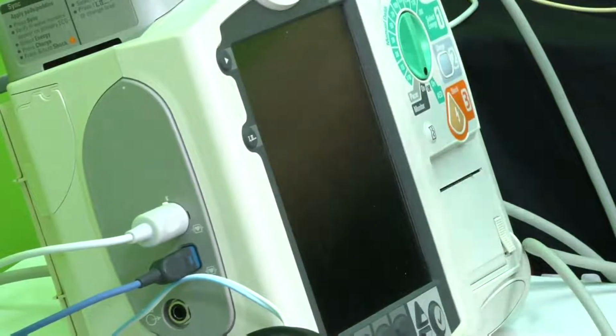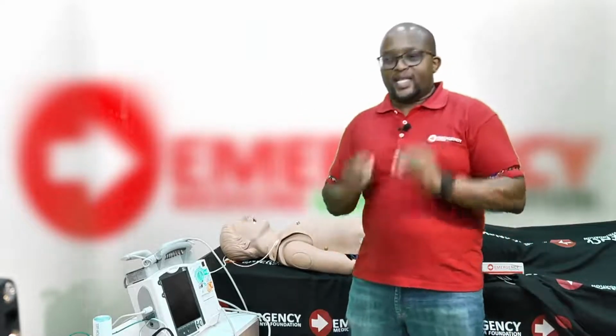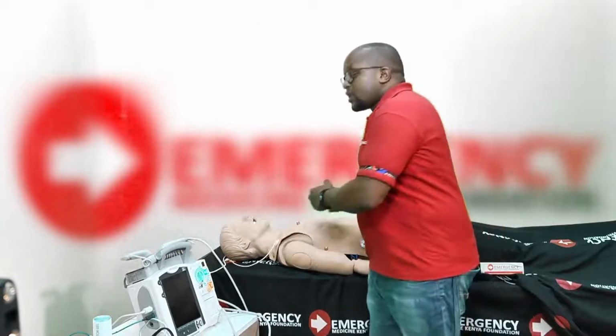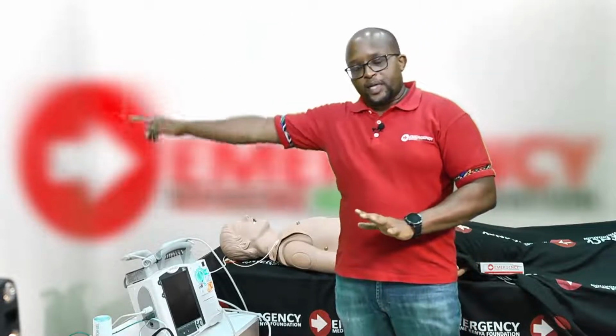What I want to emphasize is when you shock the patient, you need to resume CPR immediately. Do not check if it has worked. You will check 2 minutes after CPR. So the moment you shock the patient, resume CPR immediately. You will check the rhythm 2 minutes after.